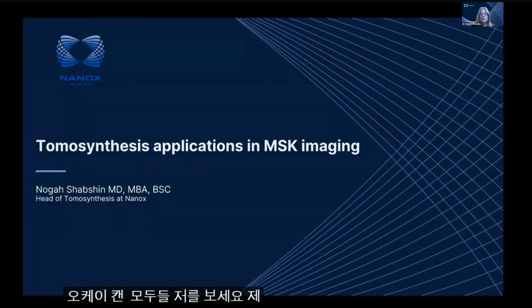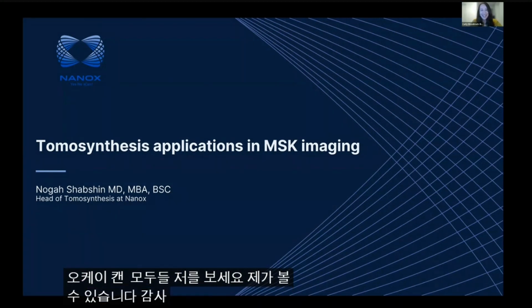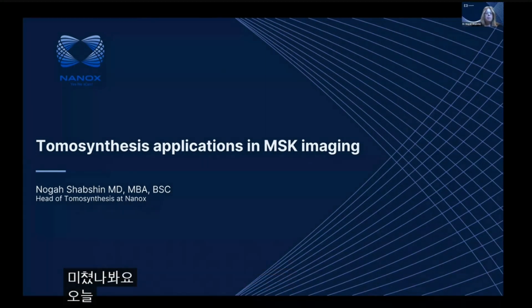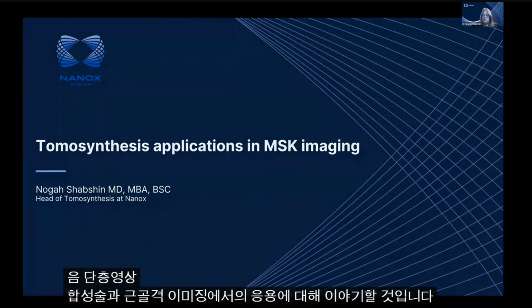Okay, can everybody see me? I can see it. Thank you. Looks great. Today, we're going to talk about tomosynthesis and its applications in musculoskeletal imaging.